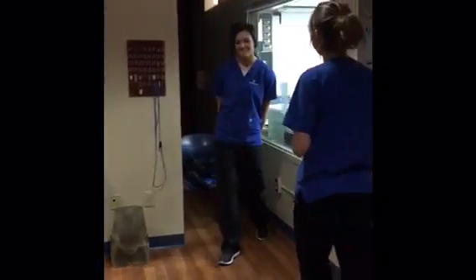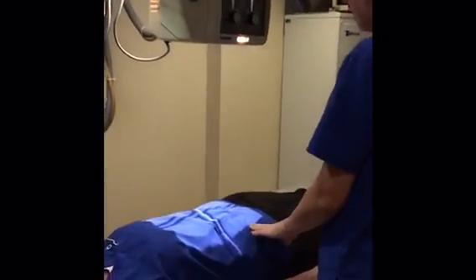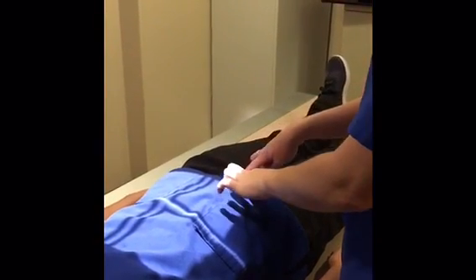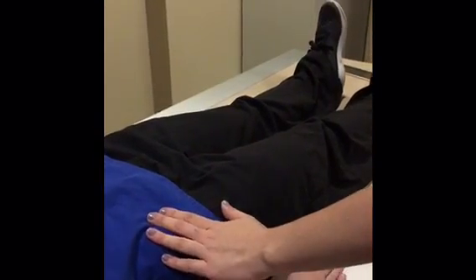Now that everything is set up, I will go ahead and get my patient, and I will have her lay down for the projection of the hip. We center between the ASIS and the pubic symphysis. We go to the midline at a diagonal line, and from that we go 2.5 inches. This will be about the approximate centering, making sure that we do include the ASIS in the hip projection.